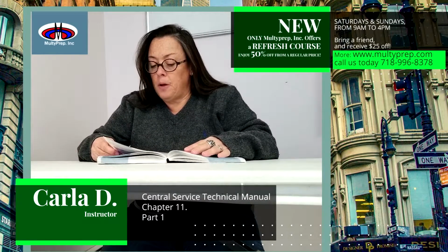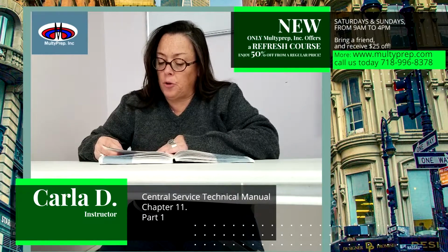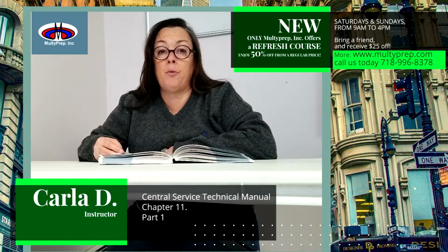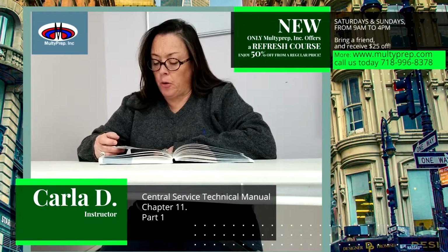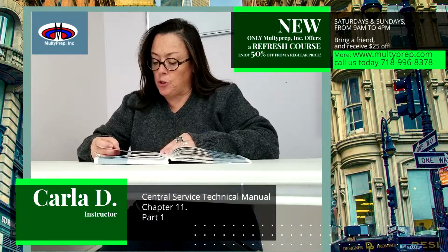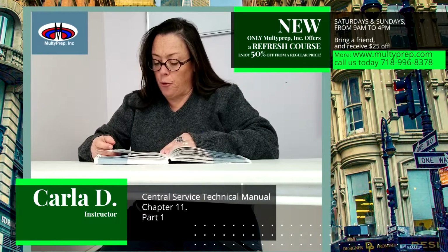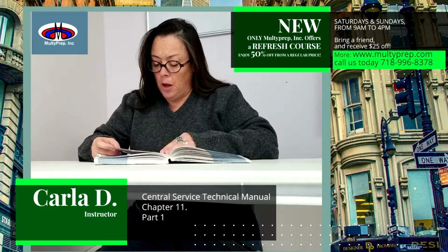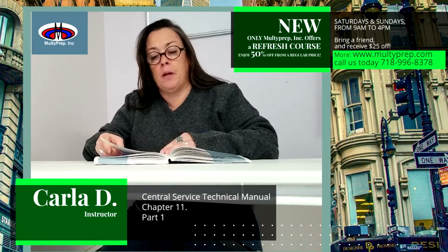An arthroscopic shaver is an example of an electrical powered instrument, as seen here in figure 11.4. The most common problems associated with electrical powered instrumentation or equipment: damage to electrical parts during cleaning and sterilization, condensation that enters the equipment when seals wear out, electrical contacts that become worn and affect equipment handling.